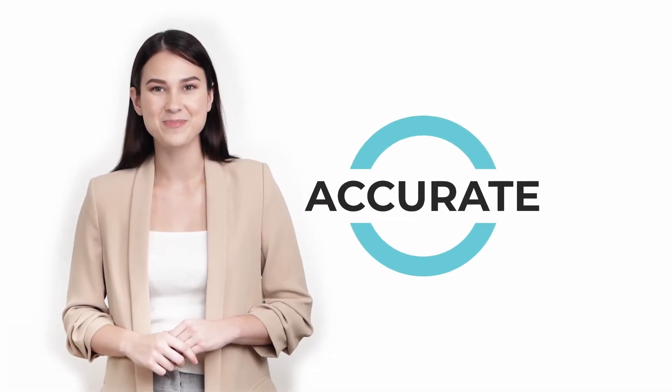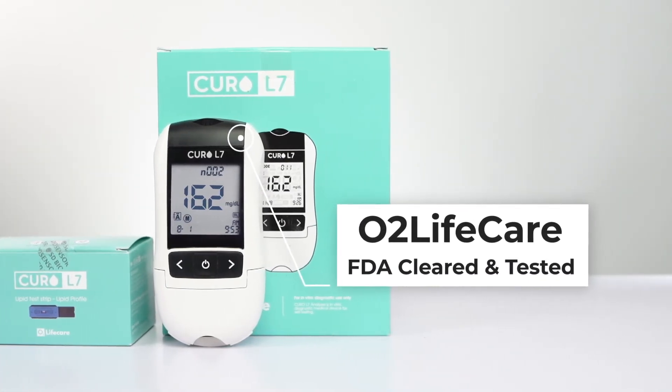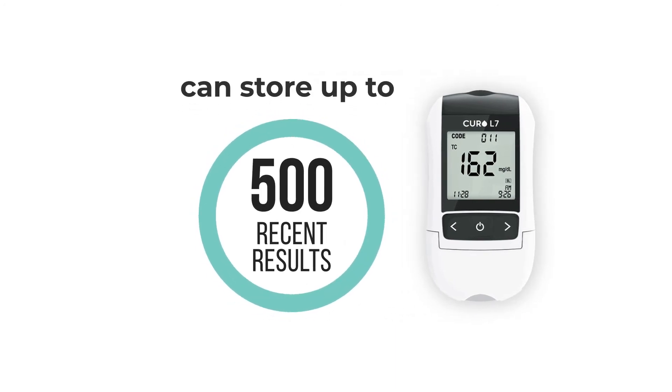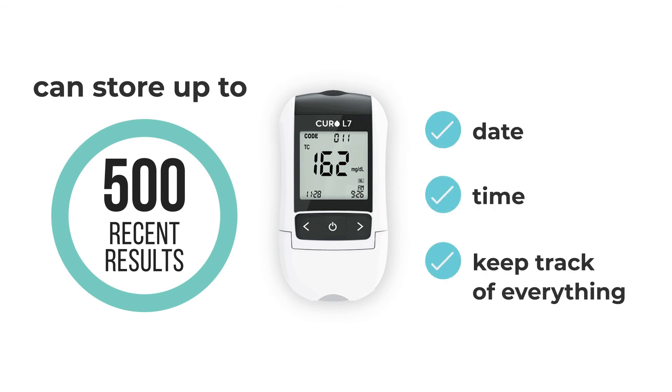4. Accurate — FDA cleared and tested for reliability by O2 Life Care Curo L7. Curo L7 can store up to 500 recent test results, complete with date and time, to help keep track of everything.